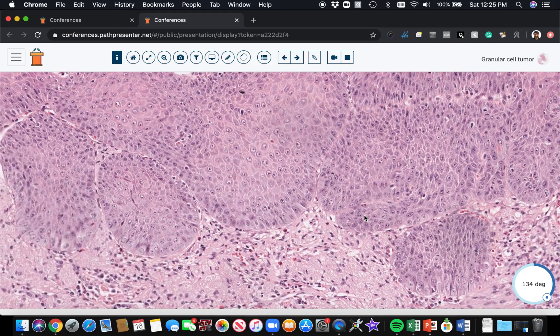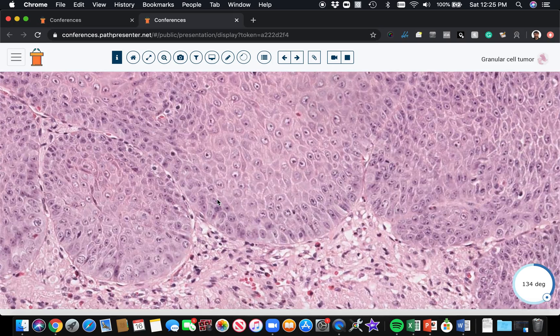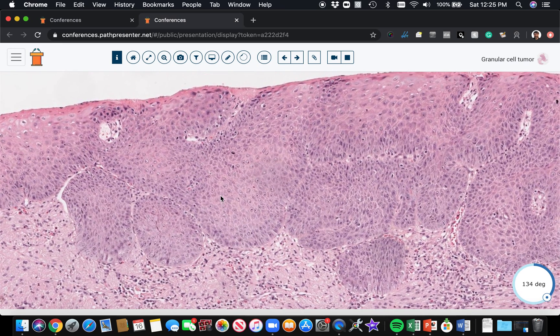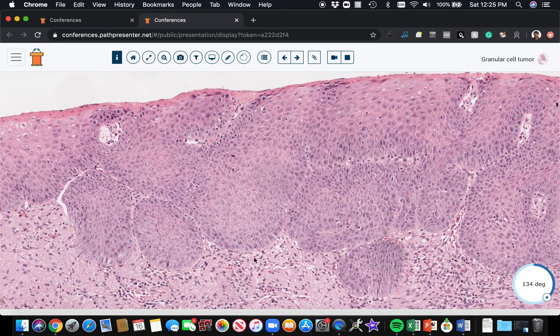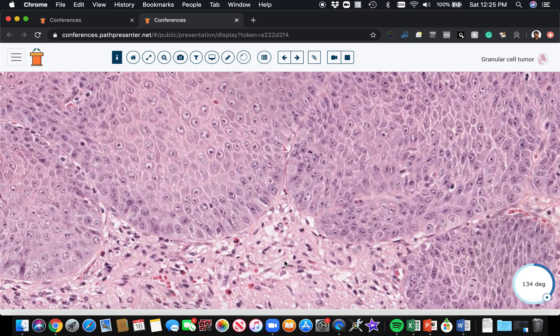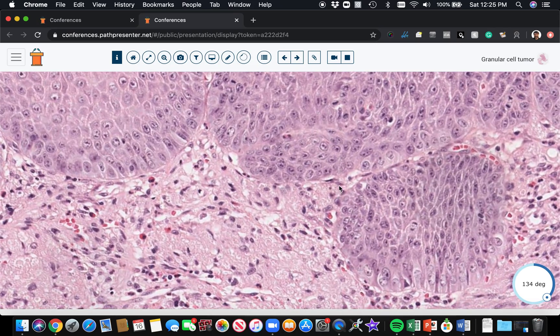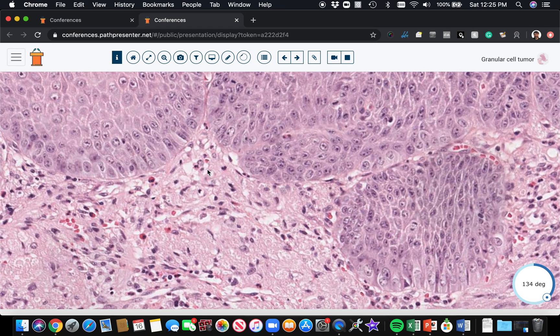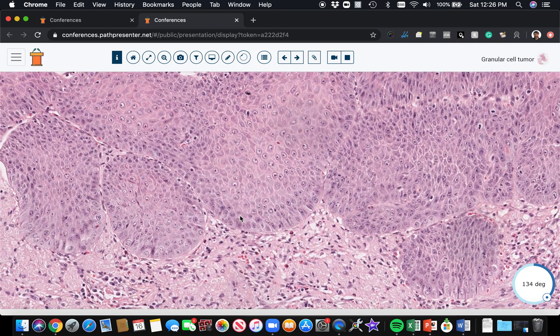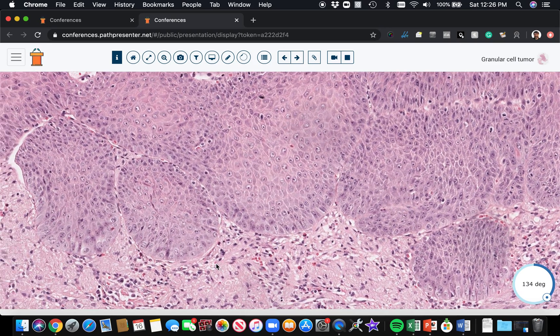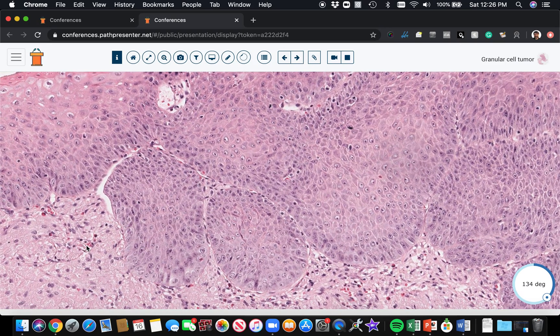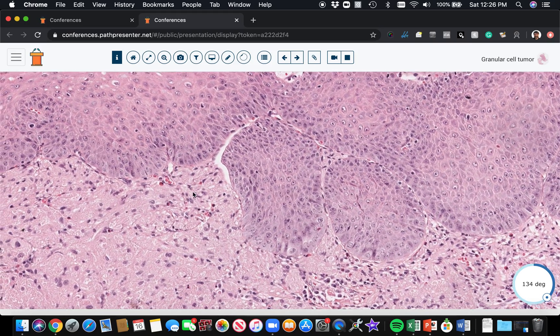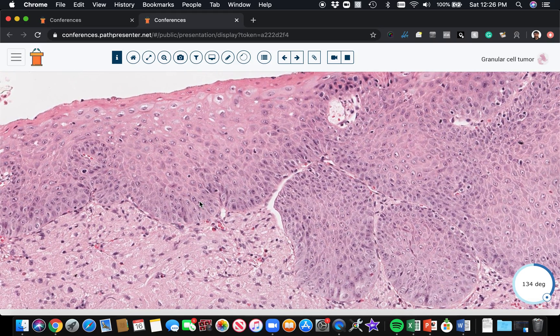These cells are more plump and large and they can look atypical. Sometimes it can really have a pseudo-infiltrative appearance. So the key is if you see a biopsy of something you think is squamous cell carcinoma, particularly on the tongue, look down here in the submucosal spaces between the islands of keratinocytes and see if you can find some granular cells. Because if you do, you should back way off from calling it squamous cell carcinoma. I've seen examples where granular cell tumor has made very dramatic squamous changes that really resembled carcinoma. I've heard of examples where it's caused misdiagnosis that was really problematic.